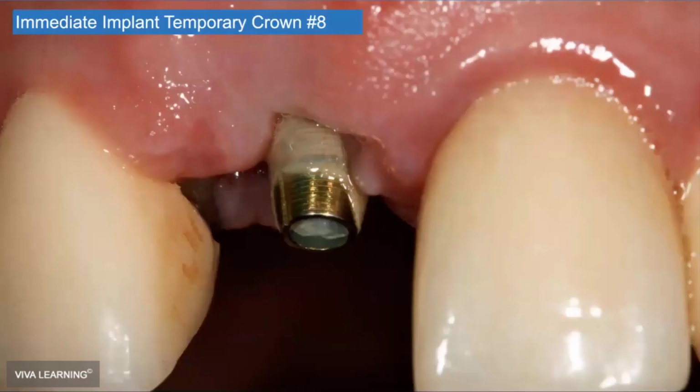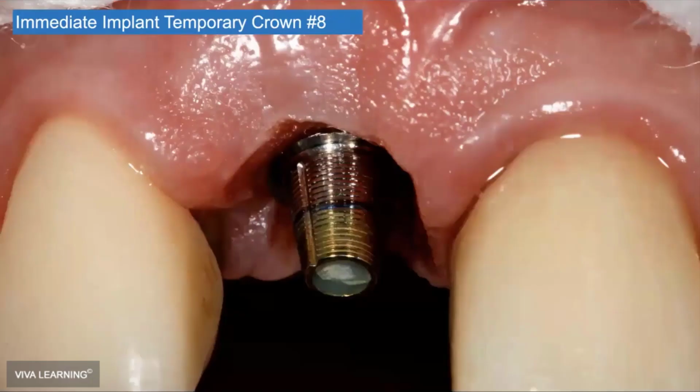So we've got another situation where the temporary crown comes off. We've got all this cement on there to remove. Soft tissues collapsing on the abutment. I oftentimes try to reuse the same abutment on the same person. And just being able to clean that abutment up super efficiently used to be a challenge. For sure, I'd have to remove it. I'd do something in the lab to try to get all the cement off. And then, of course, the tissue is just going to collapse when you take everything out.